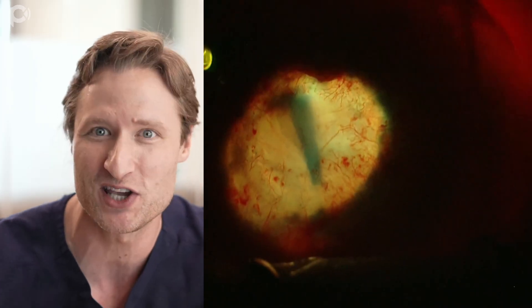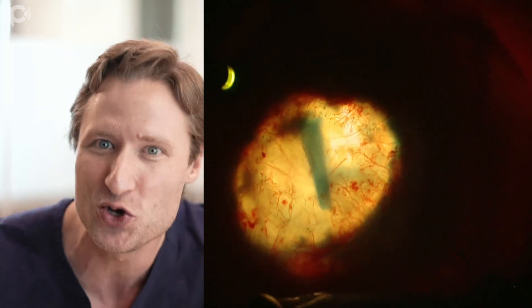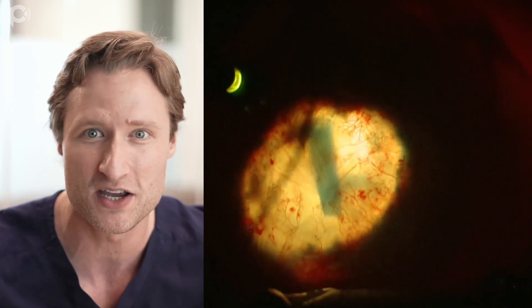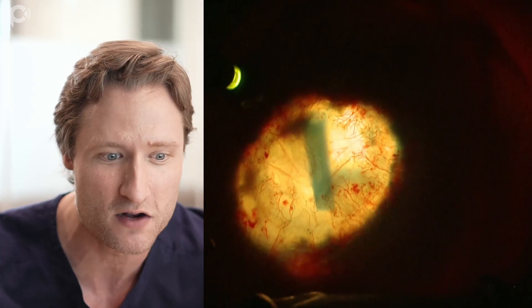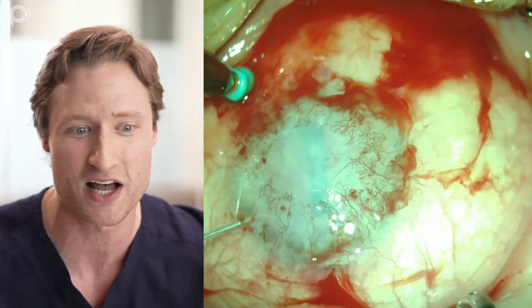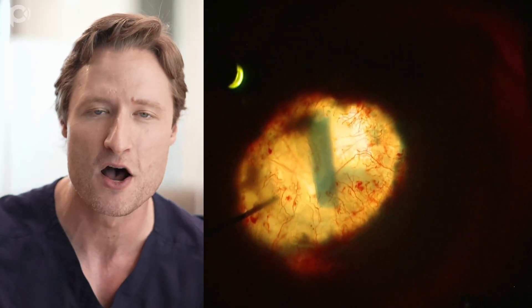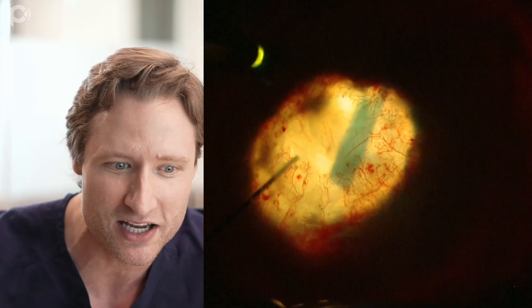This is a scary but also beautiful image - beautiful to look down at the eye and the graft there. From this point on in the video, everything is unedited, and I'm going to walk you through exactly the way that we unfold this graft. When I turn the microscope light back on, everything washes out - you lose your view. This operation must be done with the microscope light off and the chandelier on.